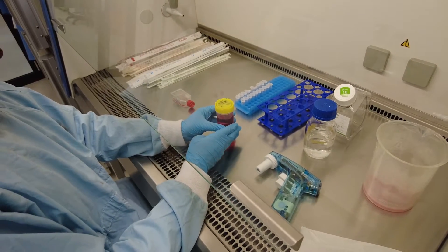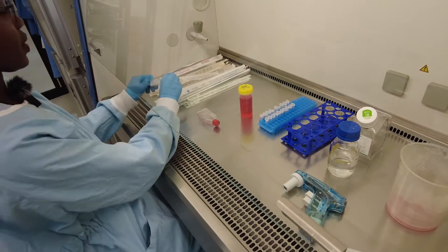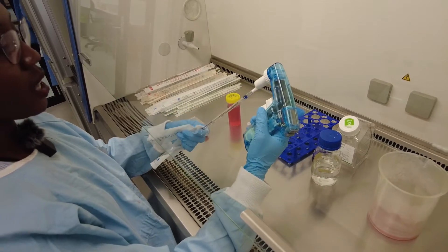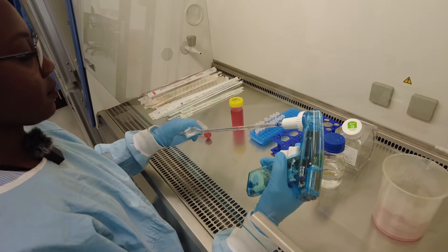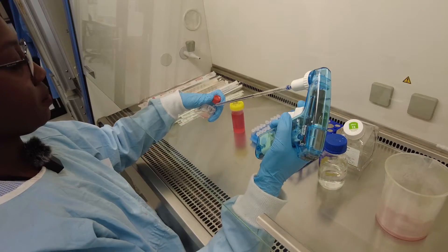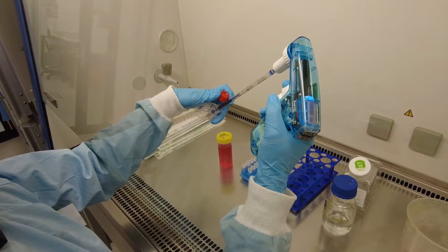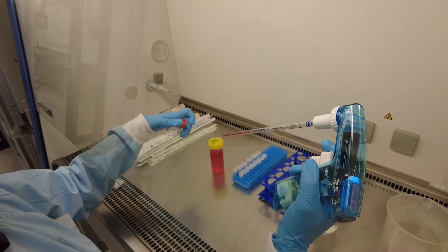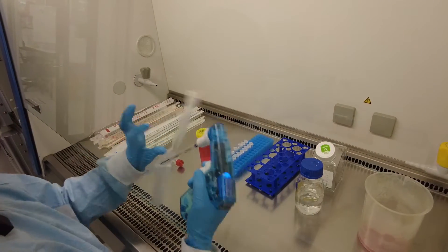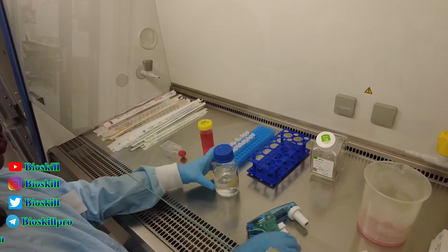We put about 5 ml with our pipette gun, remove the old media, and discard it.